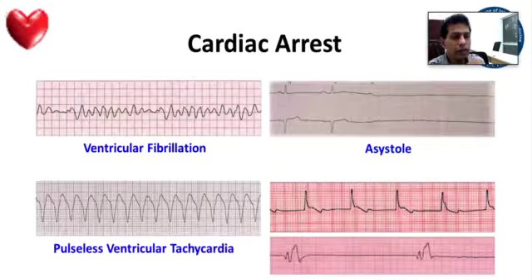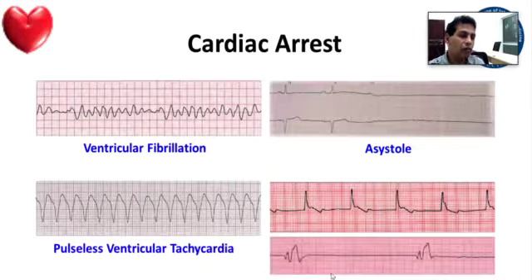Pulseless electrical activity. Again, there are several pulseless electrical activity rhythms. So I have put 2 of them. Basically, the ECG looks like normal, but you don't feel any pulses. So these are the 4 rhythms of cardiac arrest. Please don't miss them. They are important ECGs to recognize. If you miss them, you will never recover the patient.